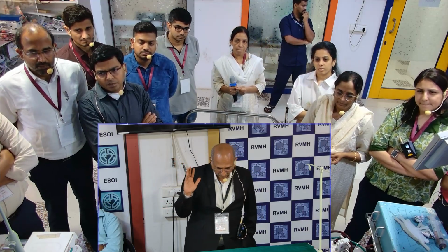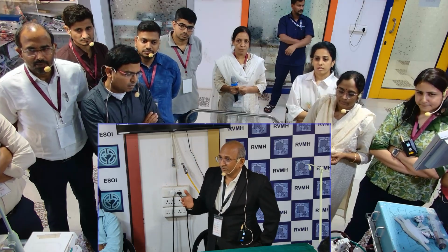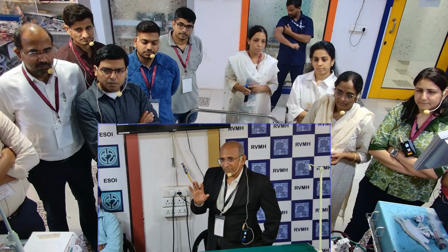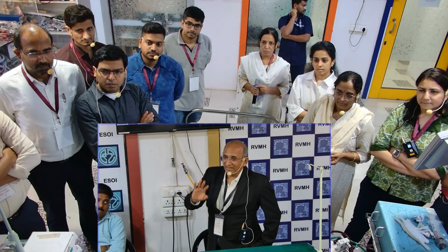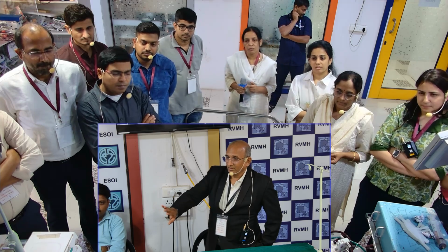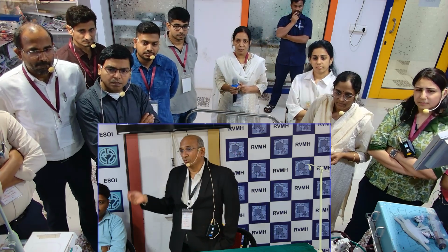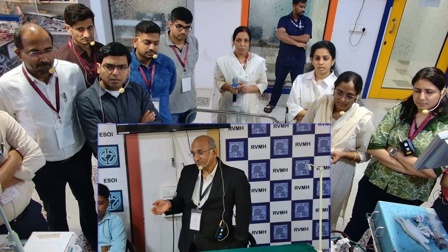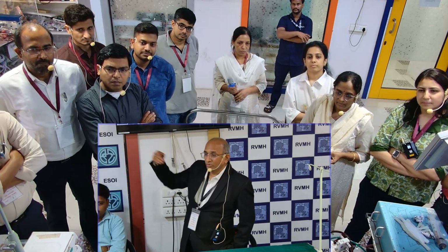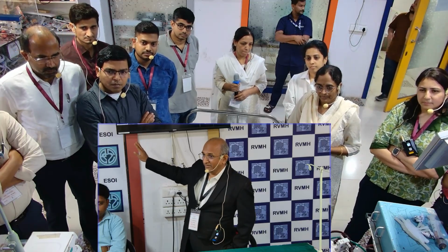Your patient will not have bradycardia. Your patient will not have a hypotension or hypertension response. Hemodynamically stable. These things will not change. So that means it was clearly a telltale sign that there is something wrong with the sweep gas failure. So now when you are thinking about sweep gas failure, start thinking from where it can go wrong, right from one source to the other. It can go wrong from the blender.